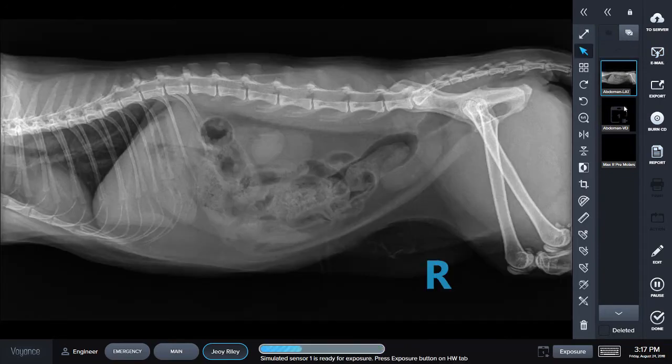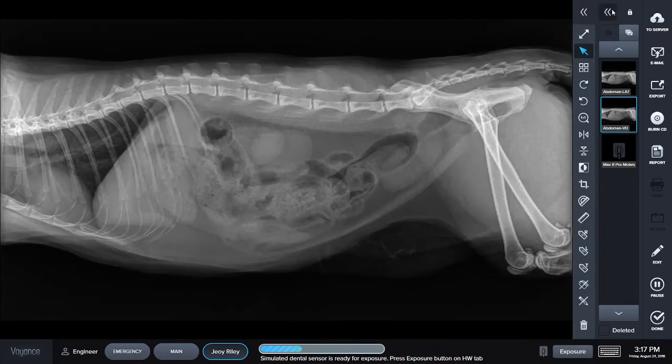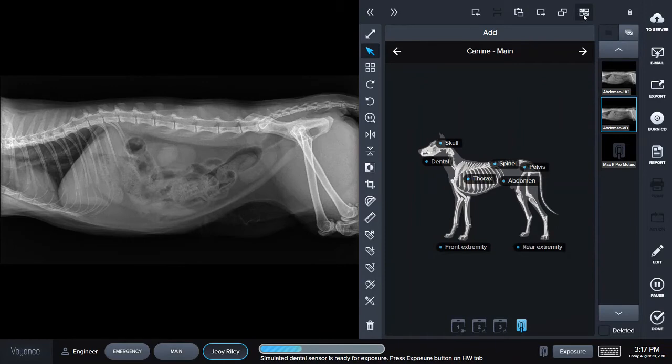Once I'm done taking my images, I have many options. I can email them, export them, burn them onto a CD, or save them in a report. I can do this with one image or I can select multiple images. To select multiple images, select this multi-selection mode here at the top and select whichever images you'd like.